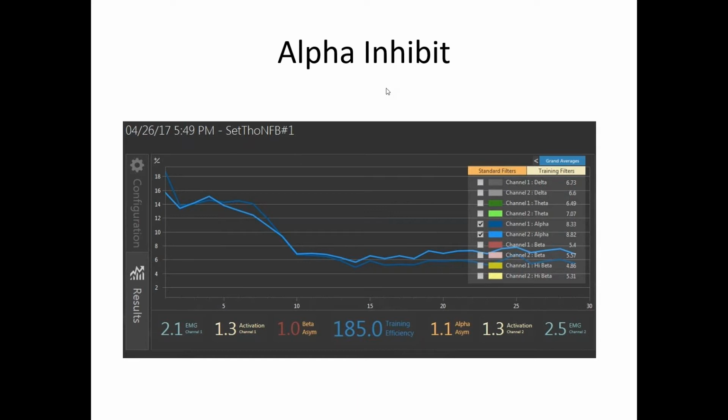So we're looking for an opportunity to help people's brains move into a more normative range, not into a rigid, defined area that we call normal, but to move into a range of biological behavior, into a range of physiological activity that allows them to interact with others in their species in a productive way that allows them to access resources. And that's the whole concept behind the ISI. It was designed based upon that theoretical perspective, and it is written up in detail, authors, citations, and statistics. So everything here is integrated in the system.